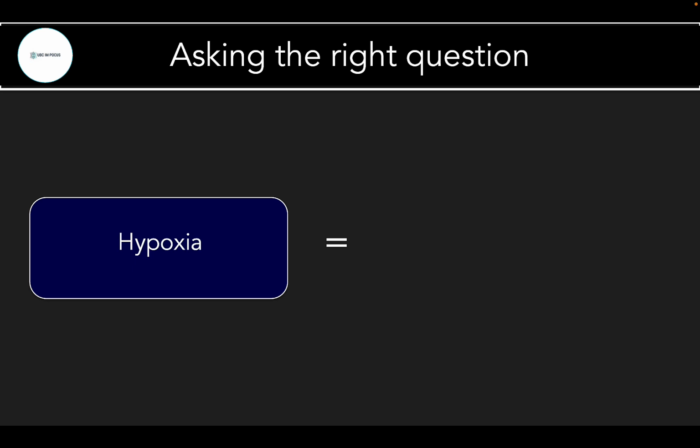Now, what about hypoxia? So we will commonly look at the IVC and JVP in patients with hypoxia and suspected heart failure. And while the IVC can be somewhat useful here, remember that the IVC, so CVP, is a right-sided measurement, and pulmonary edema is a left-sided problem. And while heart failure is often congruent, so there is both right and left-sided overload together, it is not always. So a thorough lung assessment, as well as just a recognition of the varied phenotypes of heart failure, is really essential here.